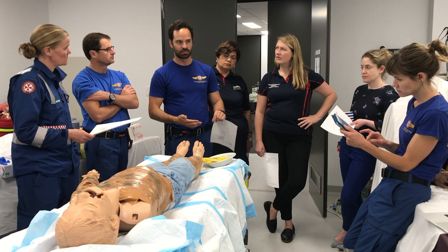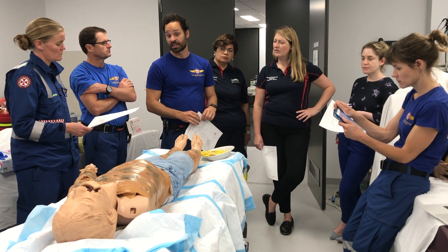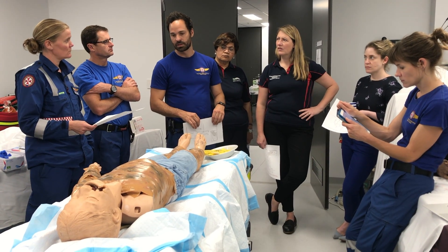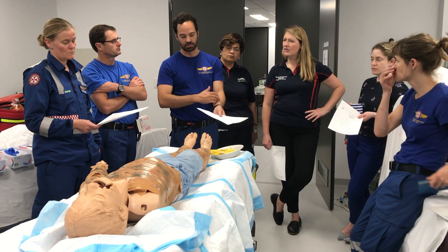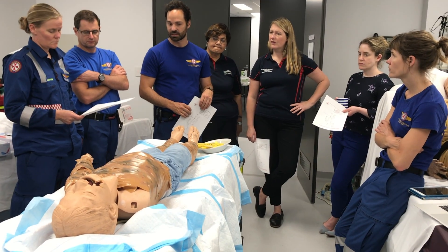It's quite difficult because of both the digital vascular supply. It's an area where you can cause a lot of harm. If you do the standard release down to the hand without the fingers, that should be enough to actually save the limb itself.